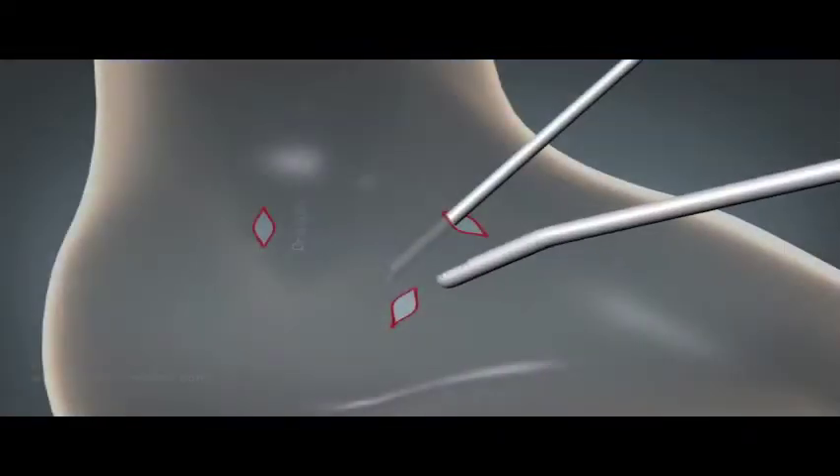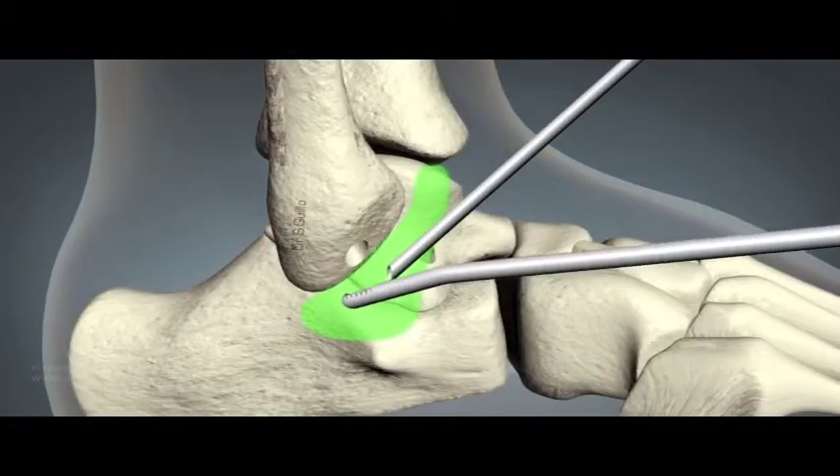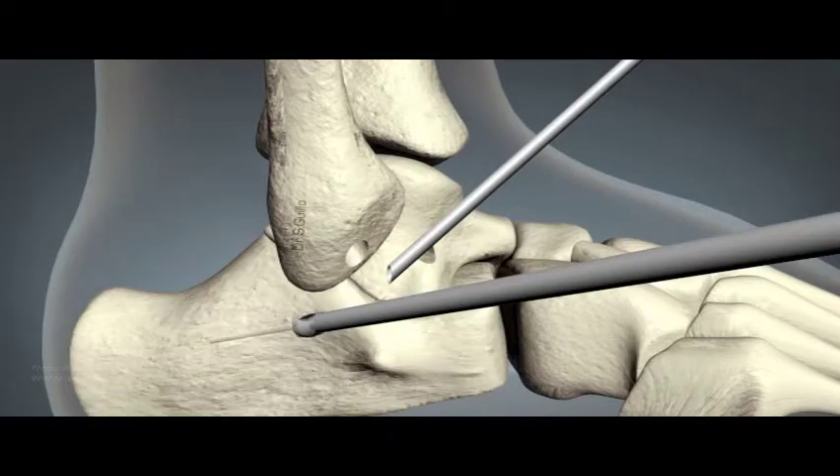Next, the scope is switched to the anterolateral portal and the CFL attachment on the calcaneum is cleared with a shaver from the inferior portal. The debridement is carried out anterior to the CFL and the peroneal tendons.